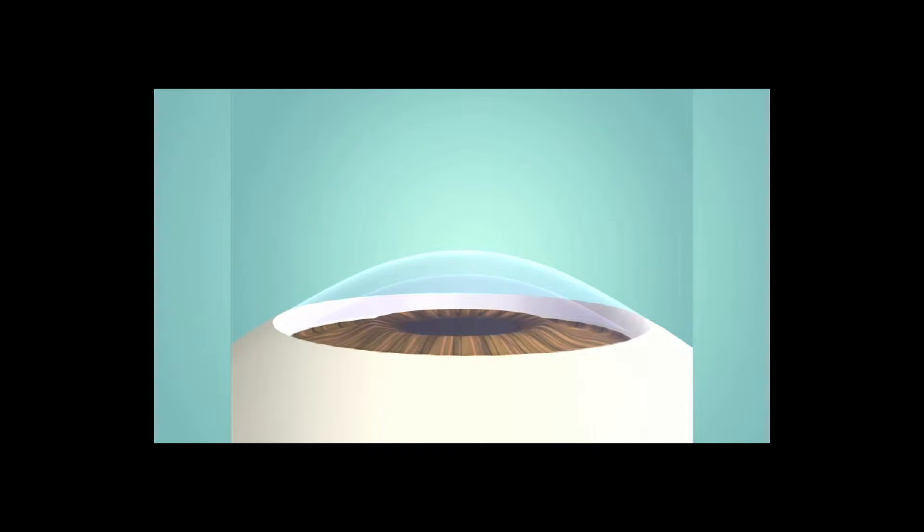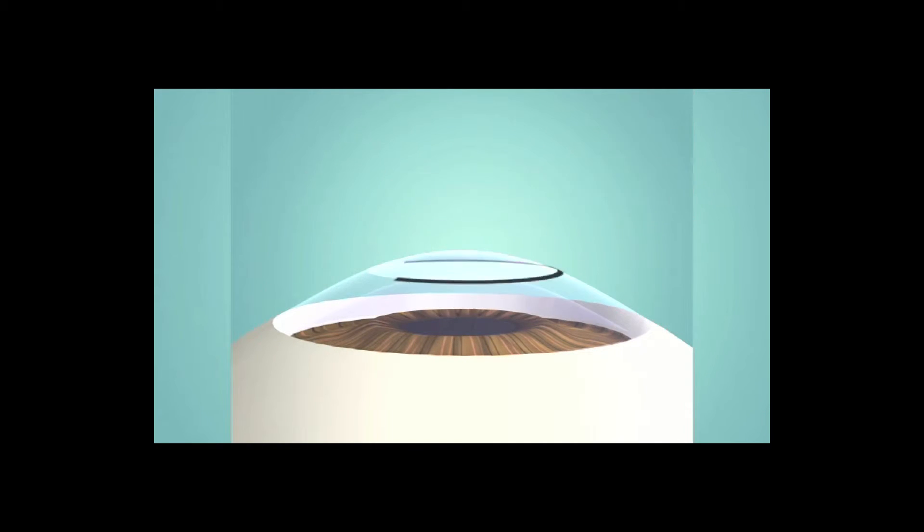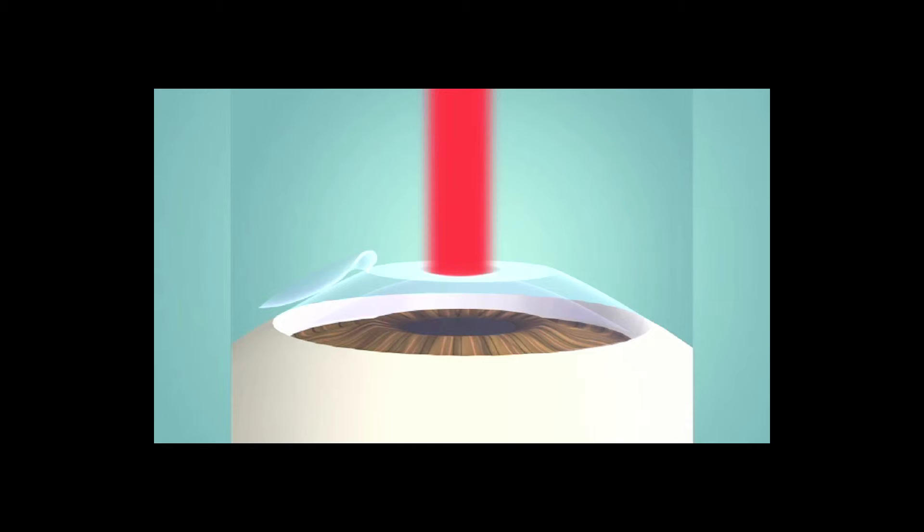With LASIK, your ophthalmologist creates a small flap in the front portion of your cornea by gently separating the tissue. The corneal flap is then folded back. Once the flap is lifted to one side, laser energy is applied for a few seconds to a minute or so to reshape the cornea.